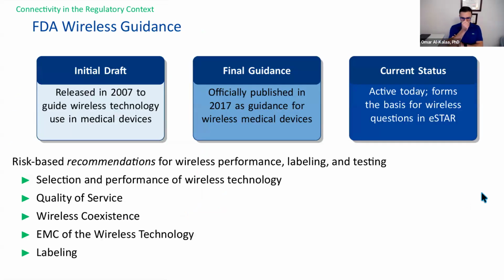So a little bit more about that guidance, because it has a lot of meat and topics that it covers. The initial draft of that guidance was released in 2007, and it was intended to guide the use of wireless technology in medical devices. Fast forward 10 years later, it was officially published in 2017, and it remains active today.